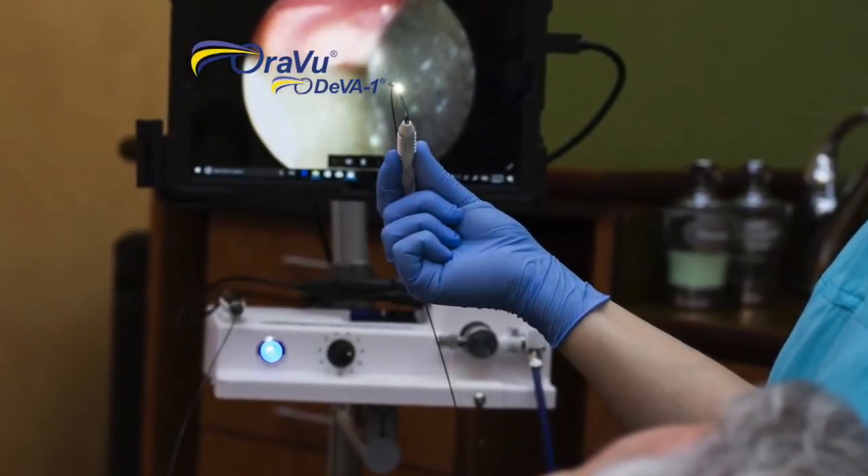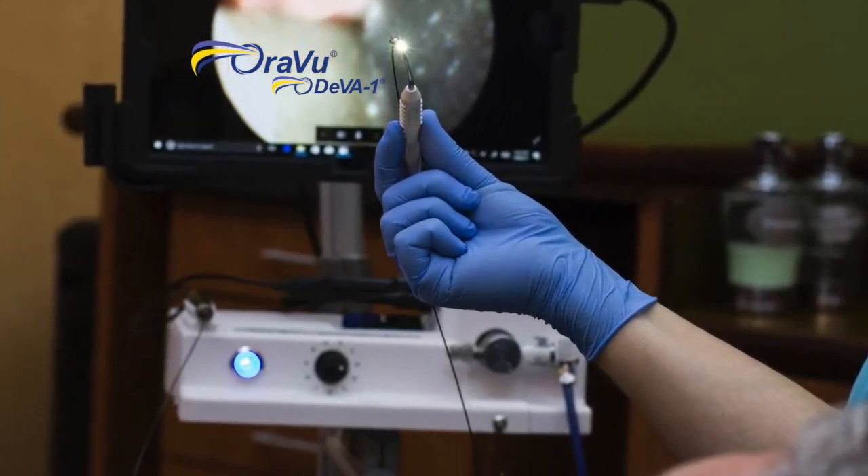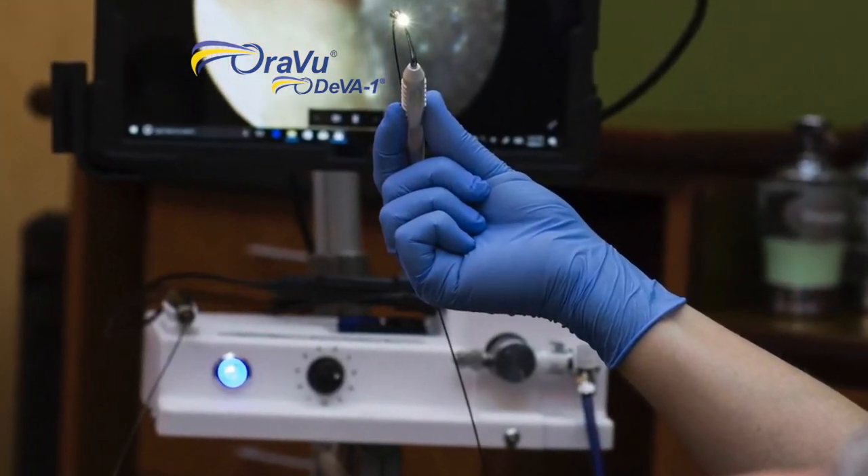Say goodbye to gingival flap surgery and ineffective blind scaling and root planing, and say hello to Oraview DIVA-1.